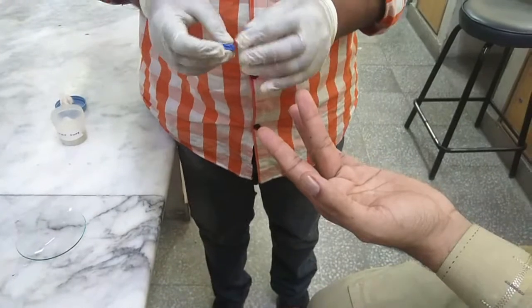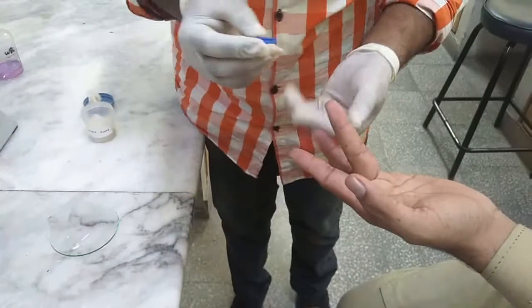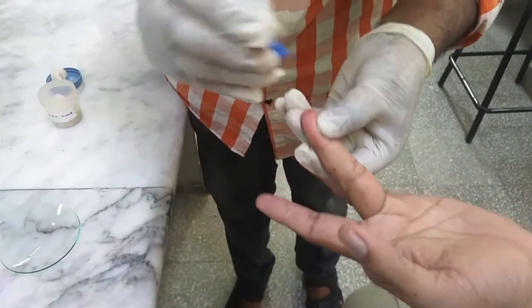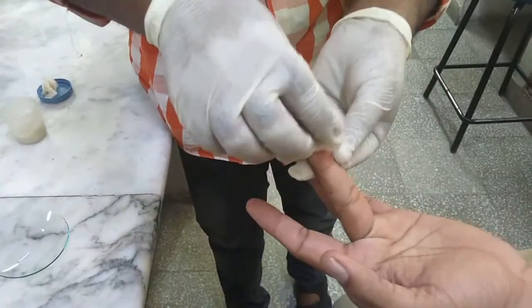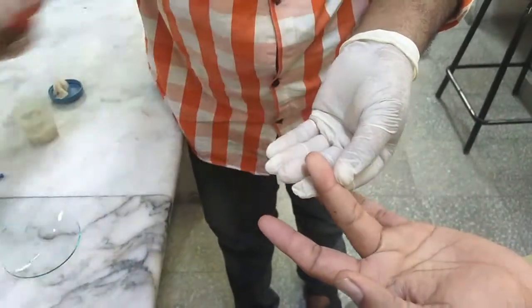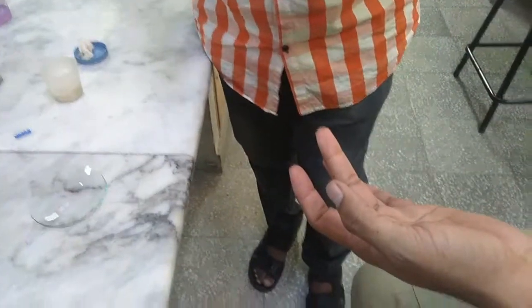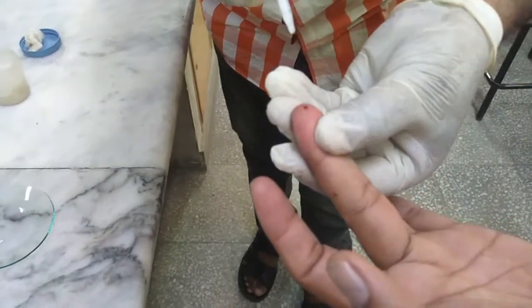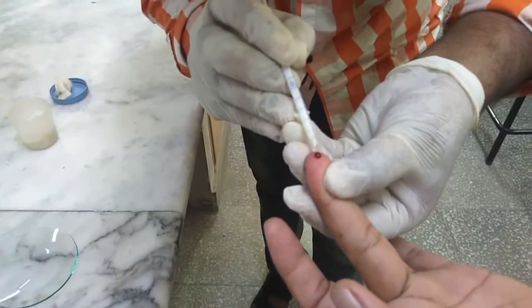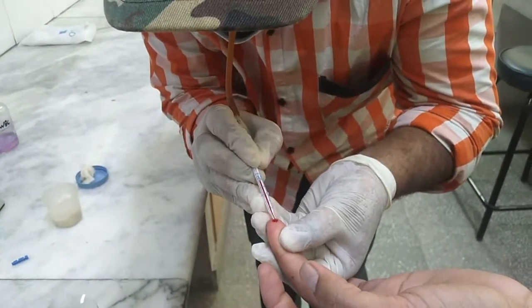After that, with the help of a sterile pricking needle, the finger will be gently pricked. Make sure to wipe off the first drop of blood. Then the finger will be squeezed a little to make a drop of blood stand out, which will then be sucked into the WBC pipette up to the mark 0.5.